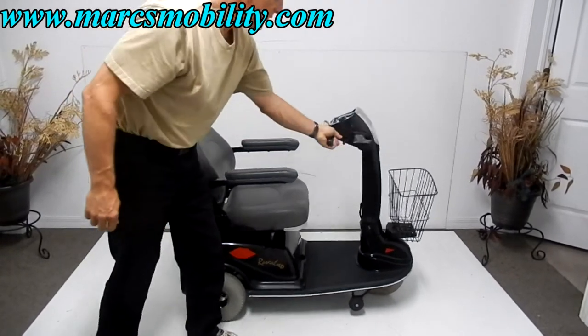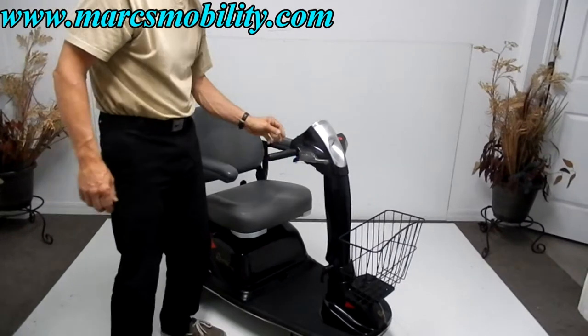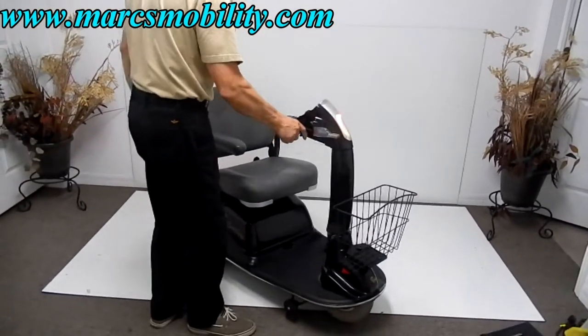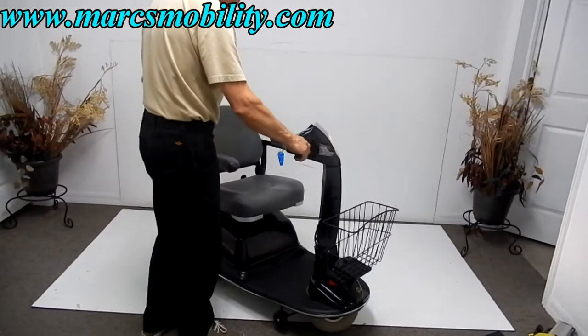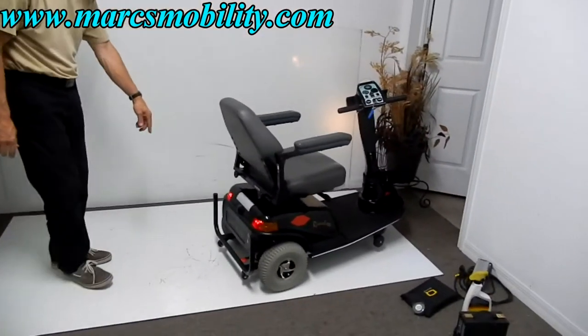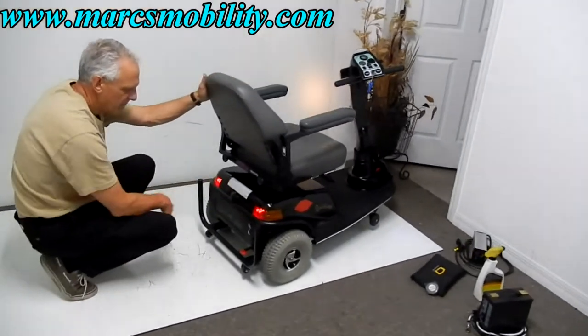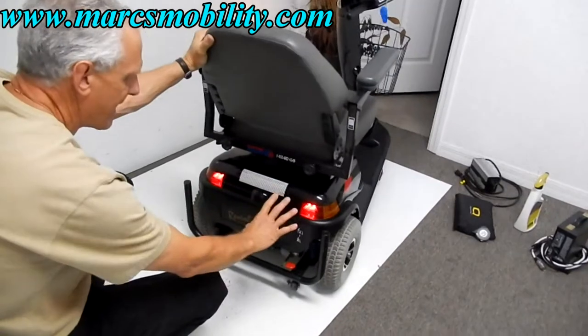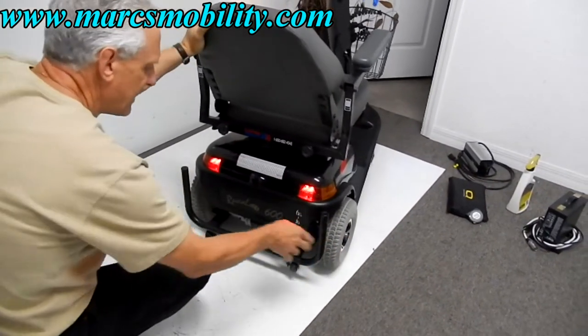This scooter also has headlights, which you can see here, and tail lights in the back. There's also a solid bumper in the rear, so if you back up into something, you're not going to damage the back of your scooter — the bumper is tied directly to the frame.